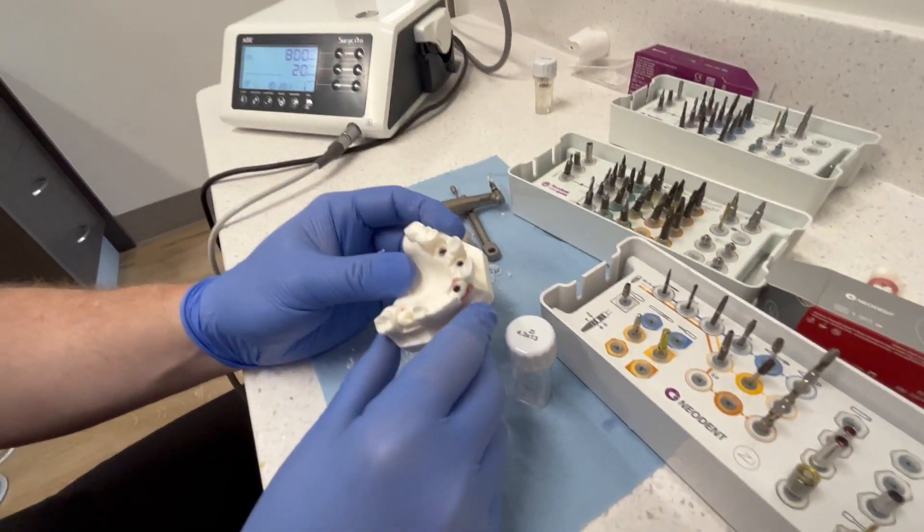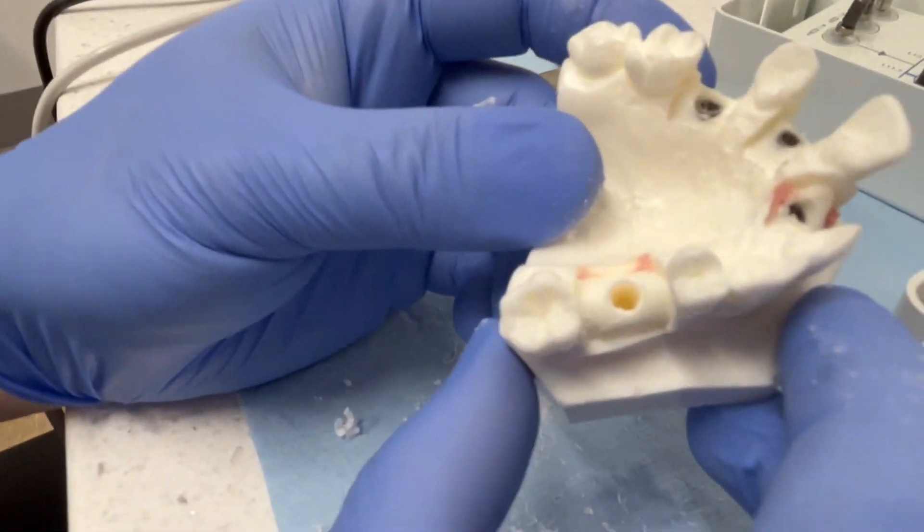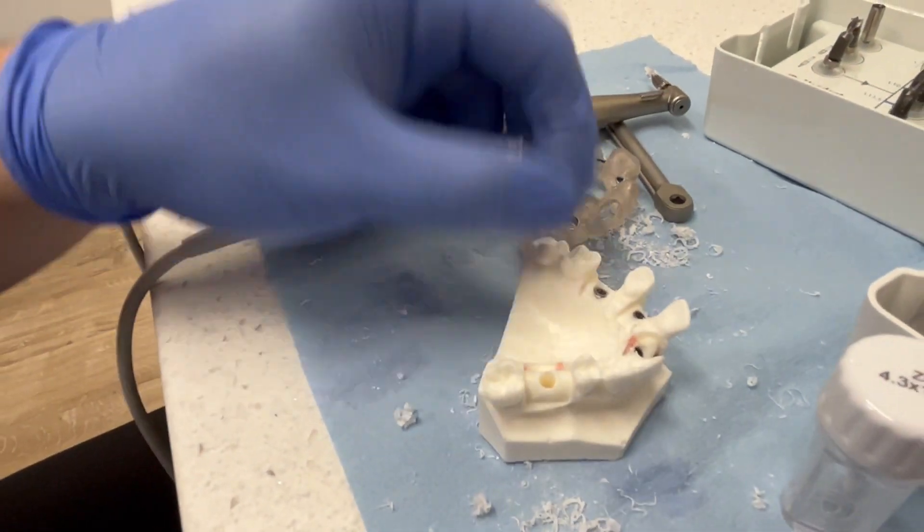So we can look right in the middle of the ridge, right where we wanted to place it. But now since we're placing a ZI, now we're going to switch to the ZI kit.